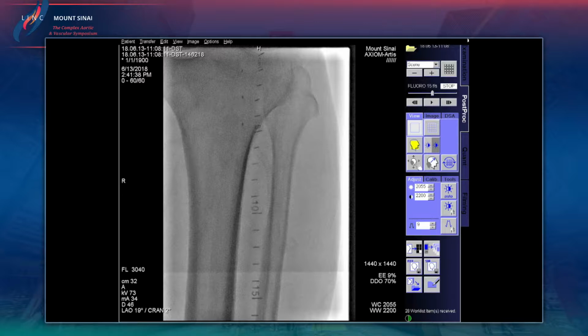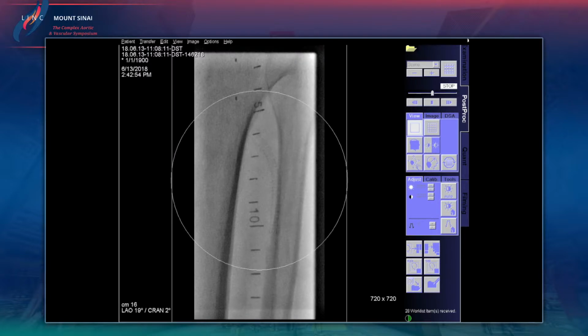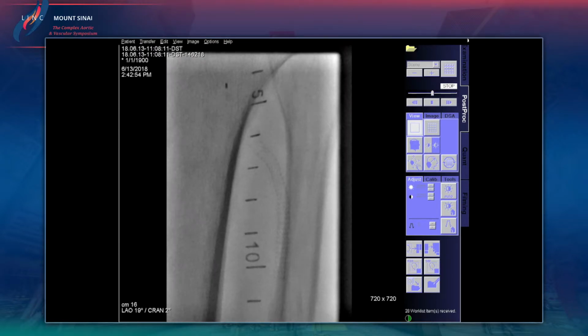So he had a drug-eluting stent in there? He did. This looks like either a Xience or this is a Xience. Yeah, this is a Xience stent. Do we know anything on timing, how long it's been there? Yeah. Definitely this has been probably in the last year. Okay. For this same ulcer? Oh, no, this is new. So he got this treatment for below the knee arteries just for claudication? No. I'm certain at that time this must have healed, and now this is reformed in this particular area.